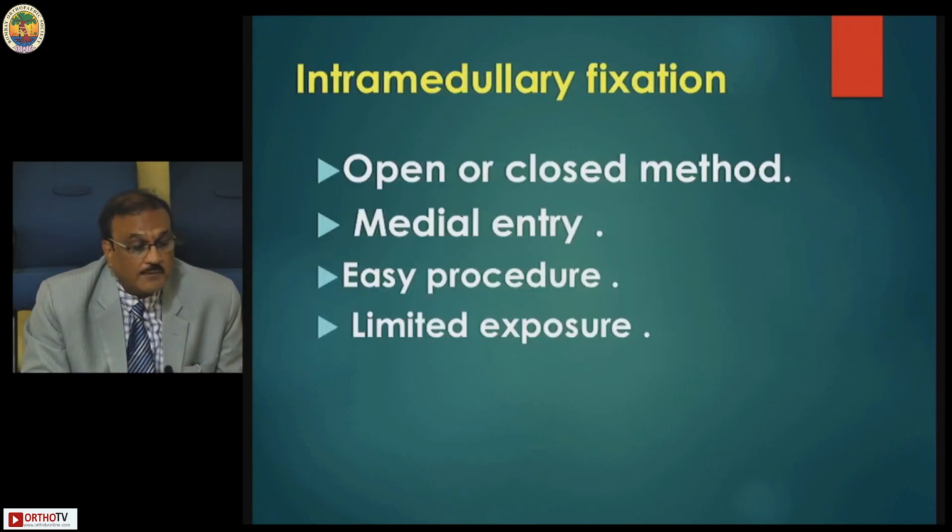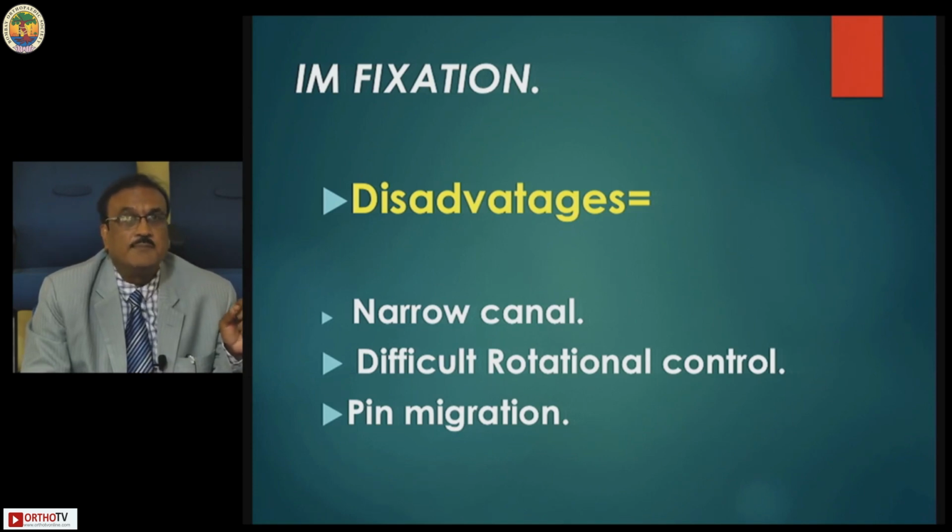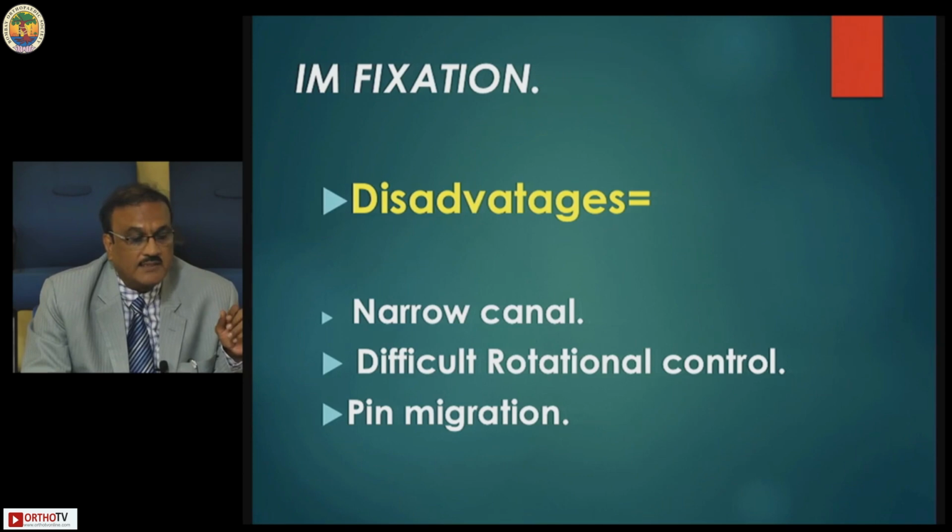So, intramedullary nail, open or closed method, medial entry, easy procedure, limited exposure. Disadvantages: narrow canal, difficult rotational control, and sometimes you may have a pin migration.